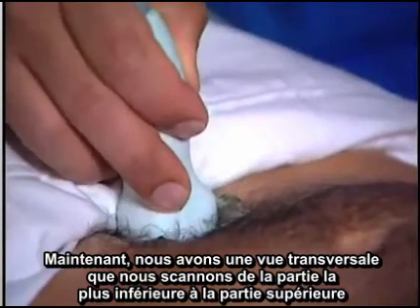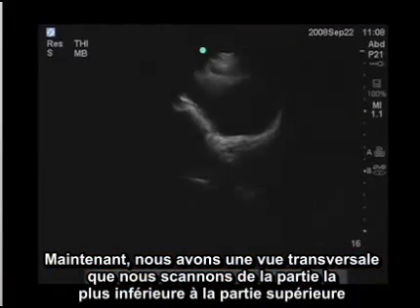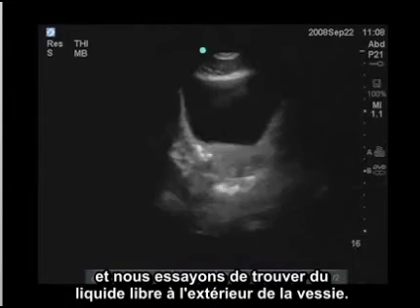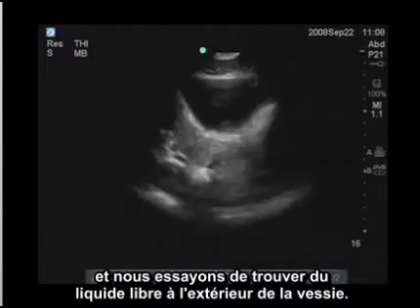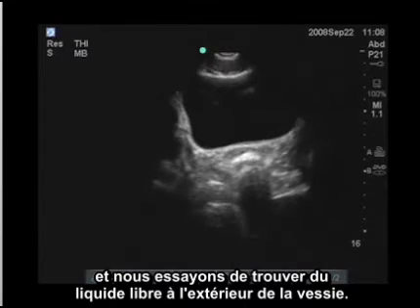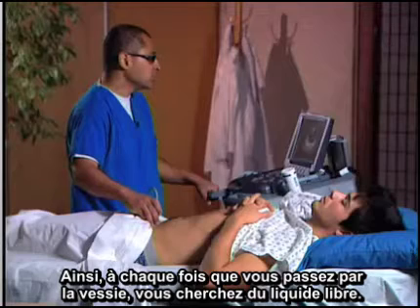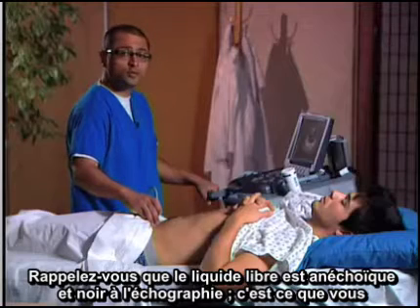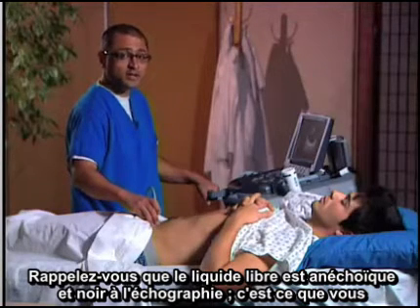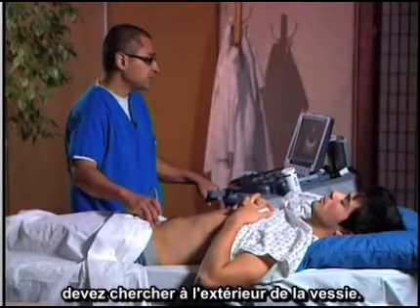Now we're in a transverse view, scanning from very inferiorly to superiorly and again looking for free fluid outside of the bladder. As you're scanning through, remember free fluid is anechoic — or black — on ultrasound, so that's what you're going to be looking for outside of the bladder.